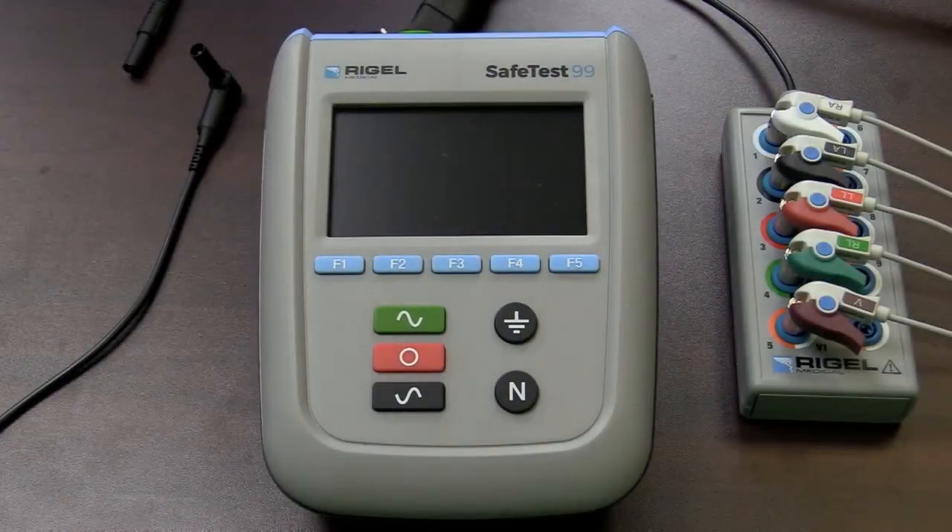This video will demonstrate an electrical safety test to the NFPA 99 2015 standard, utilizing the SafeTest 99 safety analyzer from Rigel Medical. The SafeTest 99 is the newest addition to the increasingly popular SafeTest product family. This is Jack Barrett with Rigel Medical, taking you through today's demonstration.